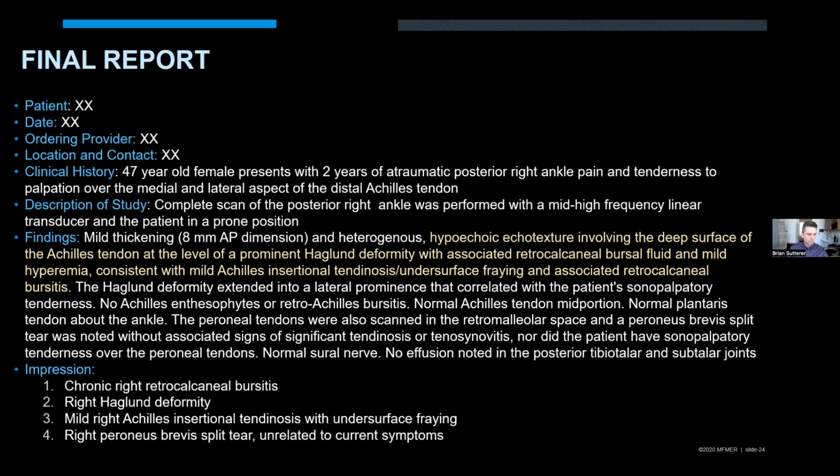I don't. Gosh, I'm sure there's probably studies out there looking at the average distance of attachment. But when the soleus goes right up to the retrocalcaneal bursa, that is a low-lying soleus, and I've seen that. Some people will even call it an accessory soleus when it goes right up to there. So for me, it's more qualitative, but I just make sure that it's not going right up to the retrocalcaneal bursa. Great, thanks. Just curious.